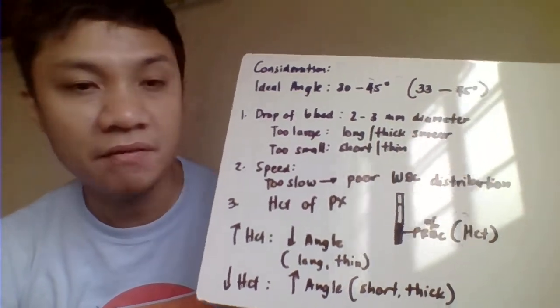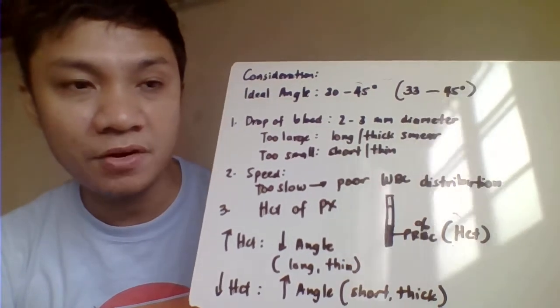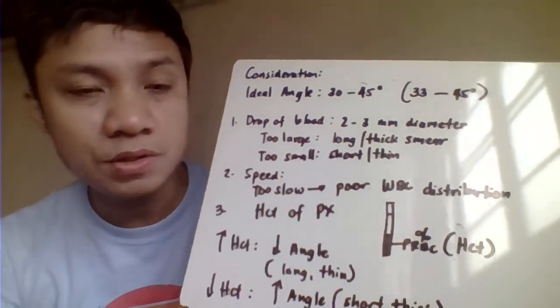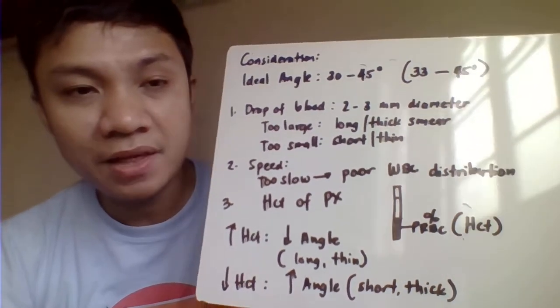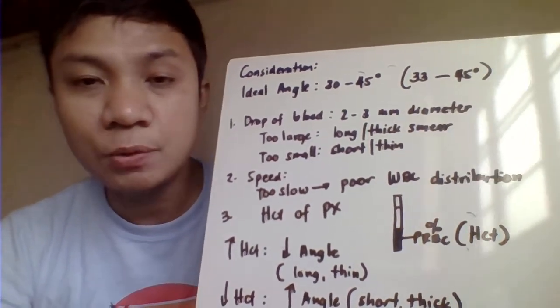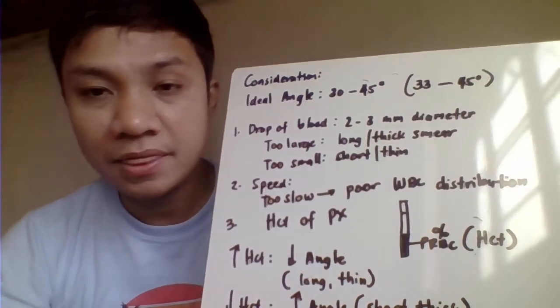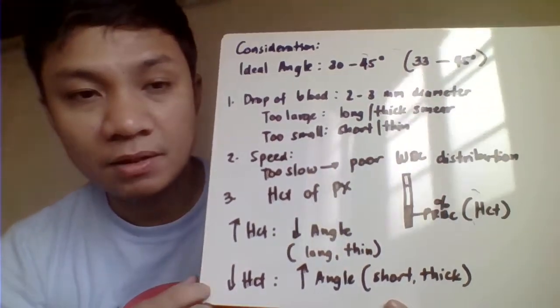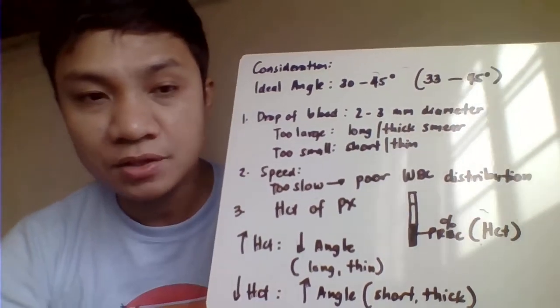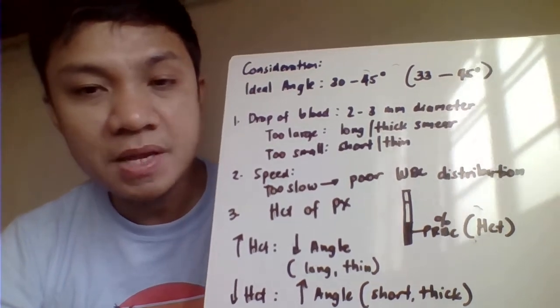The first one is the drop of the blood. Approximately, the drop of the blood here should be at least 2 to 3 millimeters in diameter. Okay, so we have that. If you have a very thick or too large a drop of blood, what you produce would be a long and thick smear. For too small a drop of blood, what you produce would eventually be a short and thin smear.